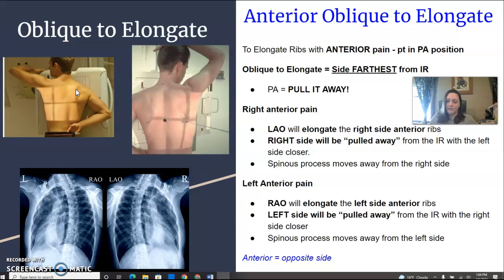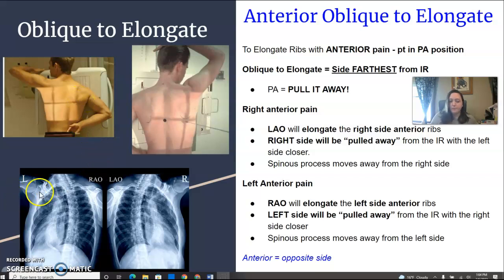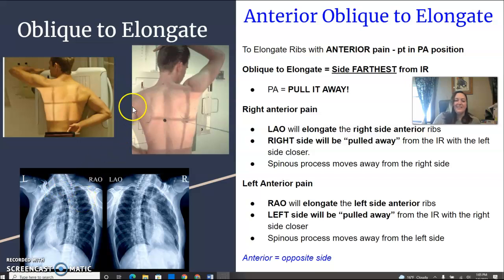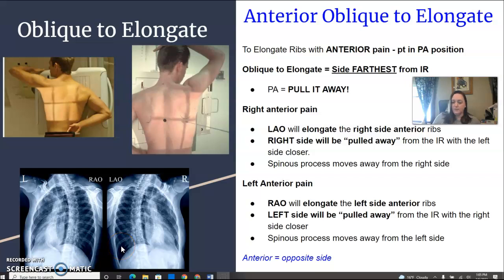Over on this side, if they have left anterior pain, you're going to do an RAO — pulling the left side away. So PA, pull it away to elongate the left anterior ribs — you're going to put your patient in an RAO, and you're still centered on the side of interest. The spinous process is going to move away from the left towards the right. So RAO makes the left side of the ribs longer. You can see the right is shorter — it's squished or foreshortened. LAO, the position he's in here — if you look down at the image — the right ribs are now elongated and the left are foreshortened. So if you think anterior ribs, think PA, pull it away. On the obliques you're going to see the opposite side.